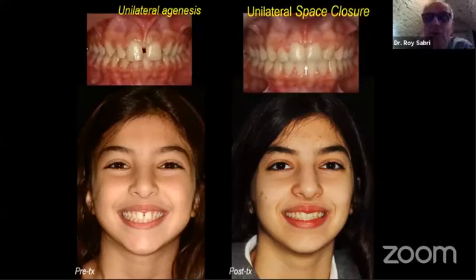And now if you look at a close-up view, midlines are on. You see that the gingival level is a little bit higher on the canine that replaced the missing lateral, but her smile can afford this. She doesn't smile really high. So it's a good outcome.